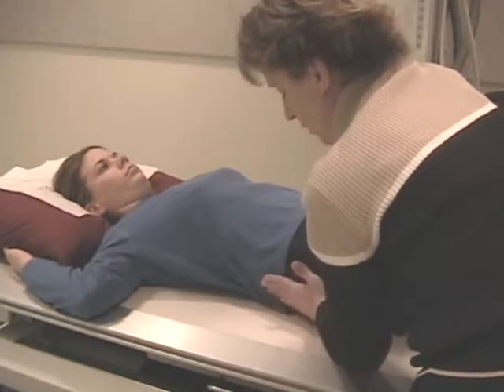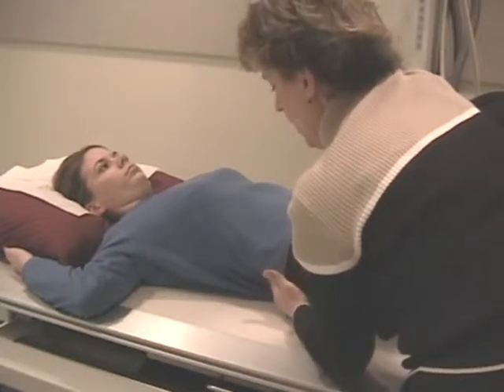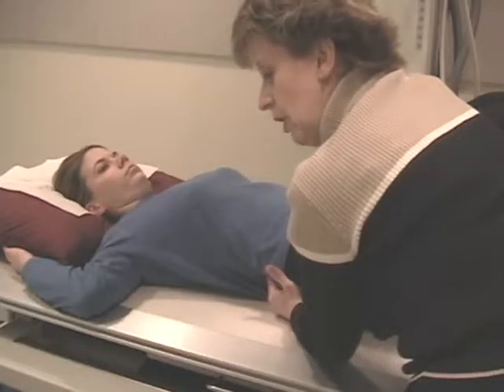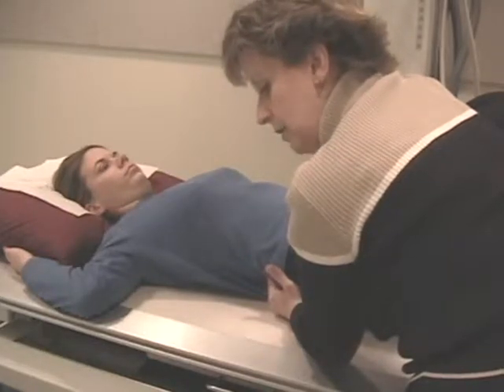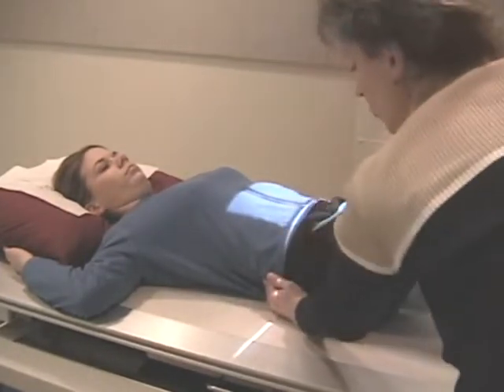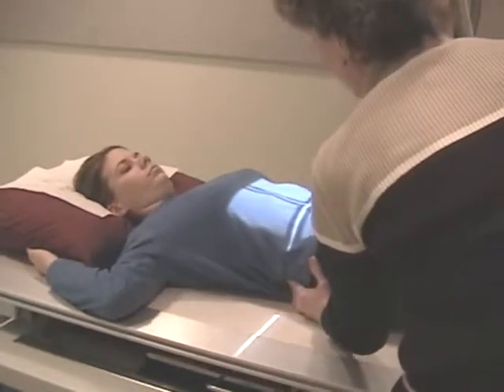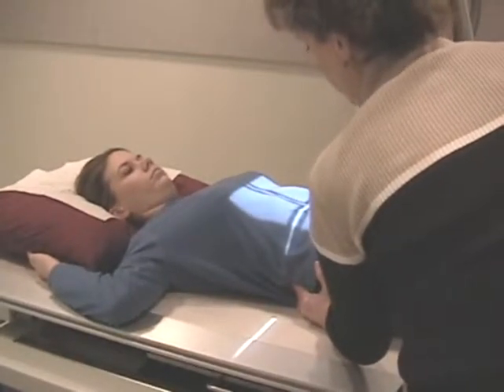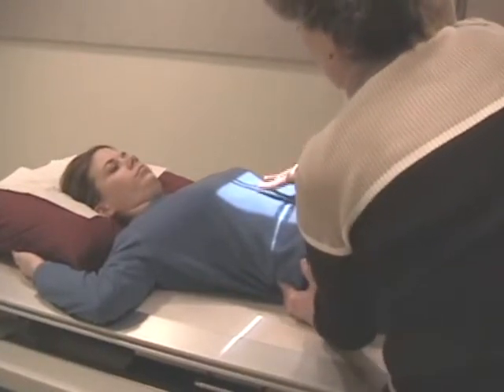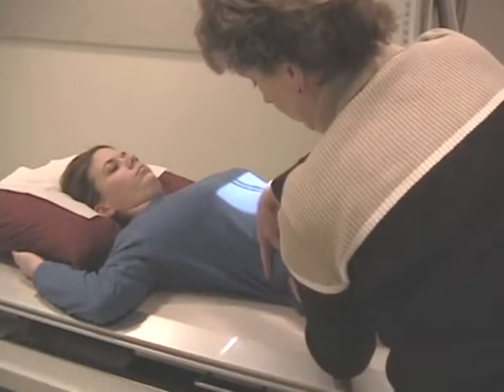See how my hands are near the edge of the table there? And I'm feeling fairly firmly, and I'm going to find the top of the iliac crest. I'm having you feel more posterior because that's the actual highest peak of the iliac crest. And then the central ray will be 2 inches above that point. Remember, my tube and my film are already lined up, so all I have to do is float the tabletop and put the center of the film 2 inches above the iliac crest with the mid-sagittal plane to the center of the film. Xiphoid process is centered, and 2 inches above the iliac crest is centered.